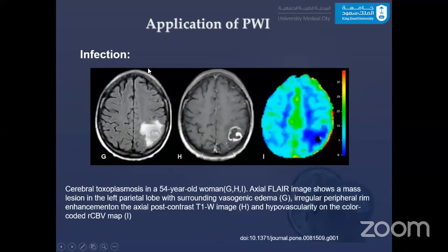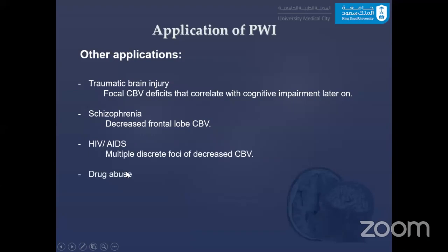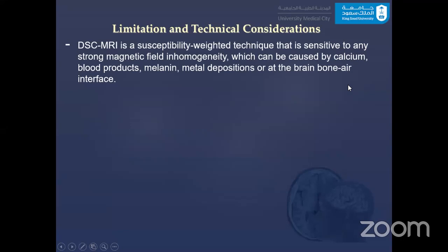Infection, usually, as we just mentioned, is always low in perfusion. I'm just rushing on time. Other applications of perfusion include traumatic brain injury, schizophrenia, HIV, and drug abuse. We will come to the last part of the talk, which is the limitations and technical considerations of perfusion.